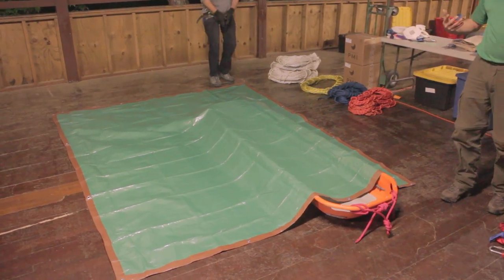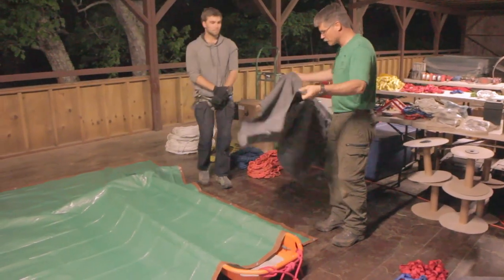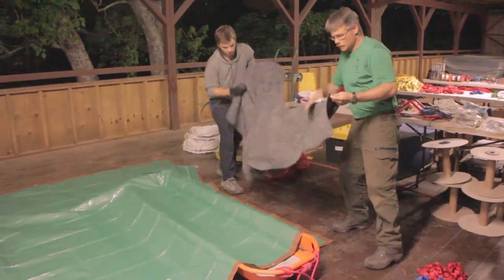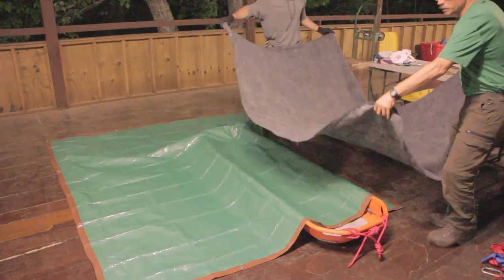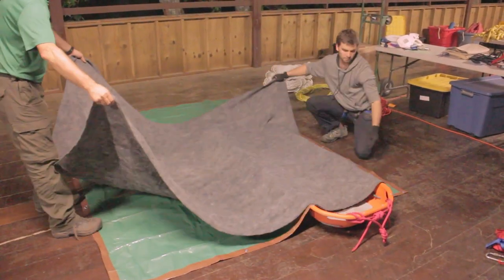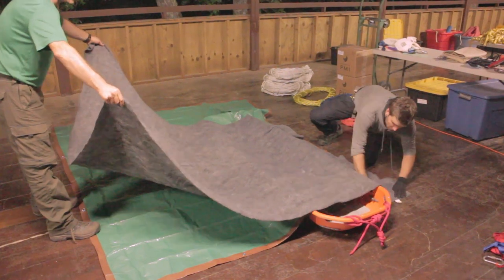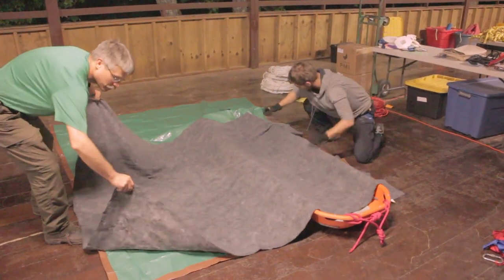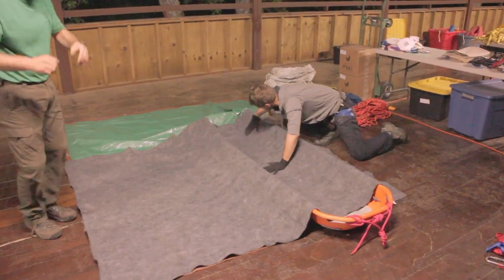The next thing we're going to do is put in some blankets for insulation. We're going to start with one here at the head of the litter, and we're going to run this one long ways. Eric is going to line his front corner up with the front corner of the package and push it down neatly. We're going to try to do this nice and neat so that there's no folds.